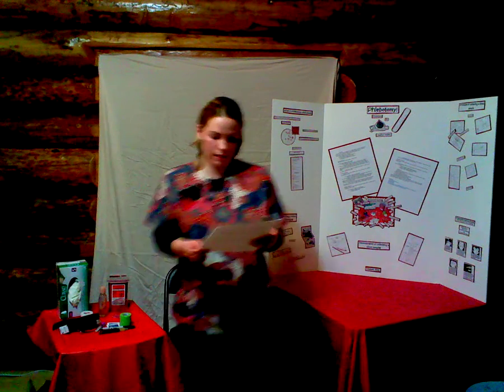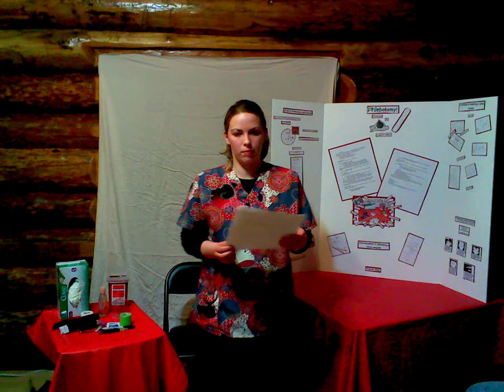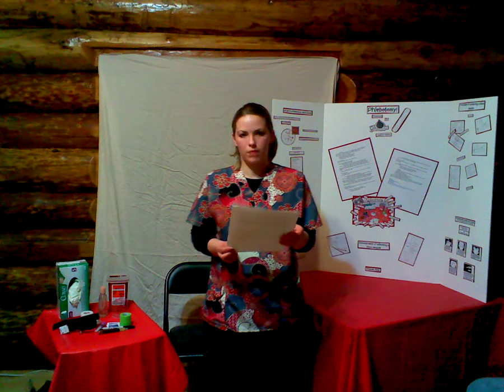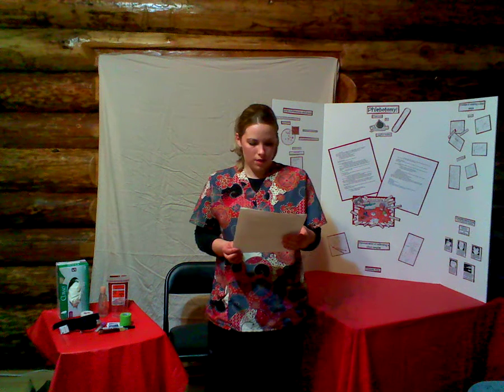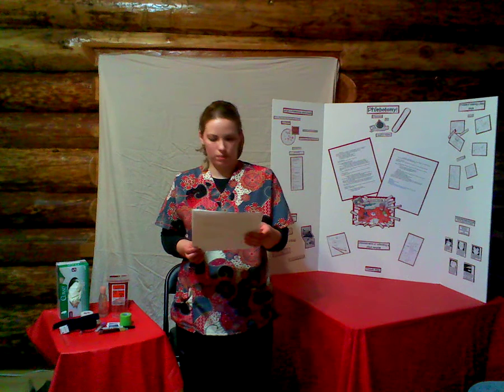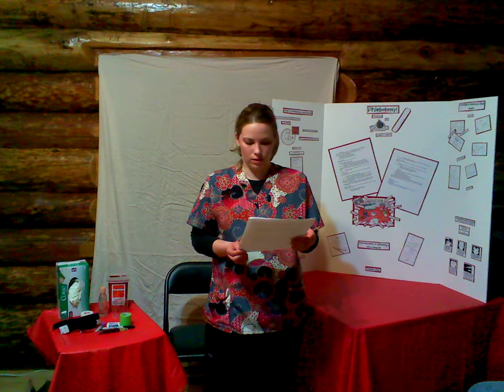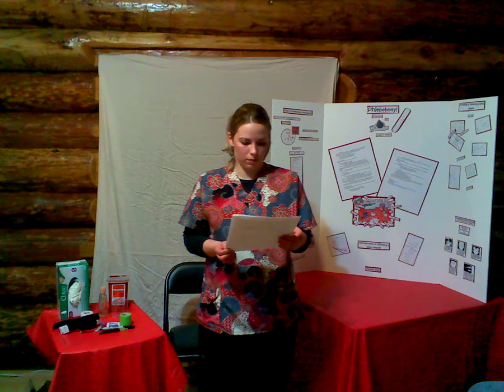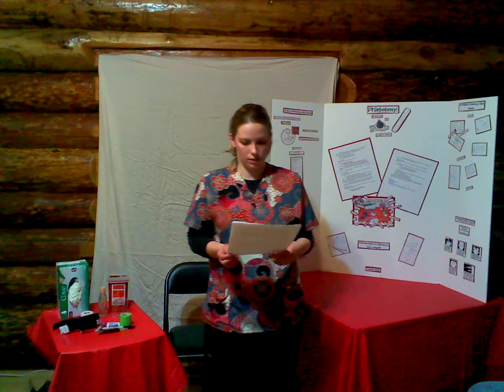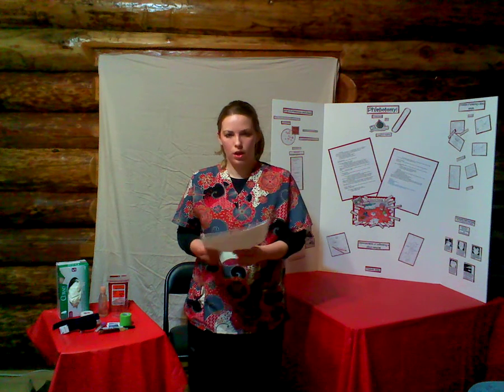Now that we all have a better understanding of how to properly obtain a blood sample, we learned what phlebotomy and blood are, the importance of obtaining a blood sample, the process of obtaining a blood sample, and we witnessed the collection of a blood sample. I sure hope this was educational for all of us. We'll benefit from being more familiar with phlebotomy and its reasons. You never know when your healthcare provider might order some lab tests.